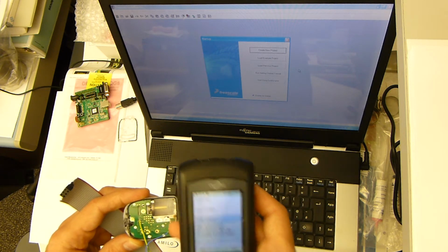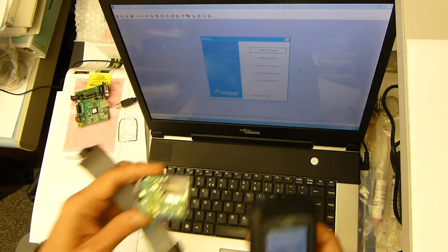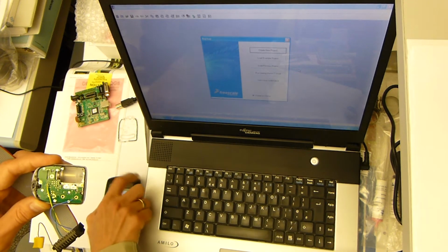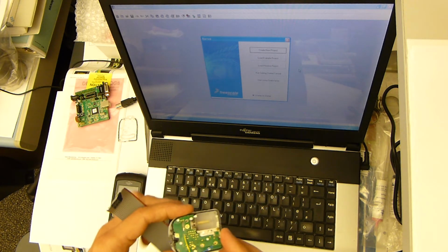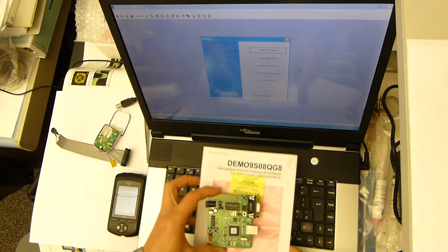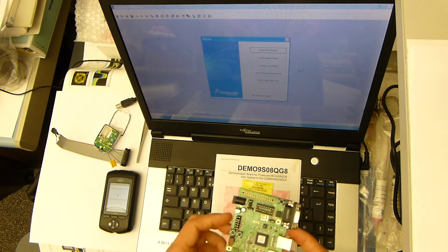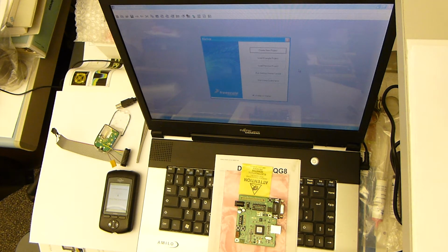So if we try to communicate with the pod, there will be no success because the pod was used and was deactivated. So you can see there's a communication error demonstrated by the PDM. In order to reprogram the flash inside the pod controller, we need a programmer. As a programmer, I use a very simple Freescale demo board. You can buy this board for less than $50, and the board comes with the software to compile your own project, to debug it, and also it can act as a flash memory programmer for any Freescale HC08 microcontroller.